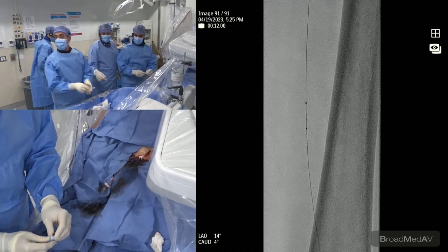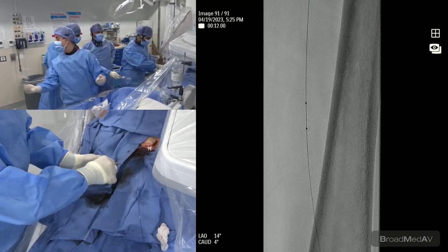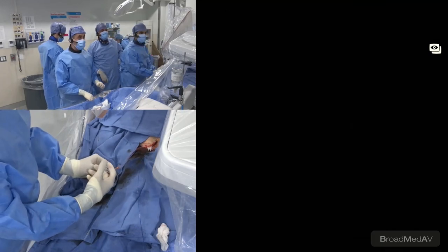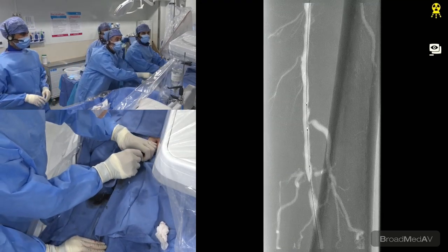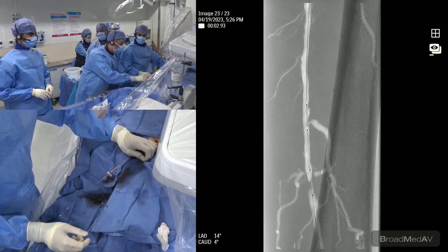Hold on, just passed it. Give a little dye, please. Yeah, well. So we're going to do a little roadmap here. OJ, can I have the thing? Can I have the thing? Oh, you have to inject. You can use this if you want. Can I get some 10cc syringes? Okay, do it. You're on roadmap. So we're going to go ahead and set it up.